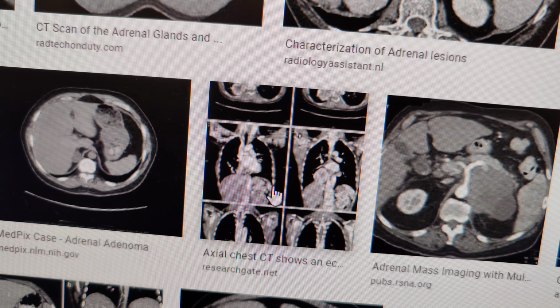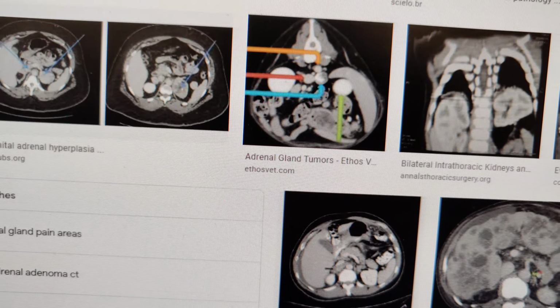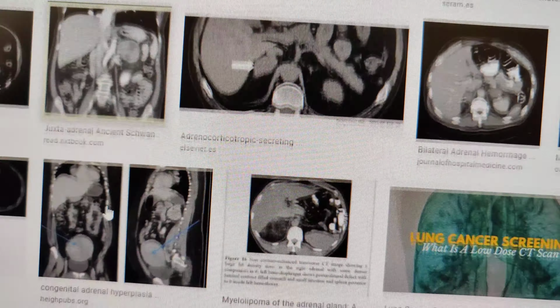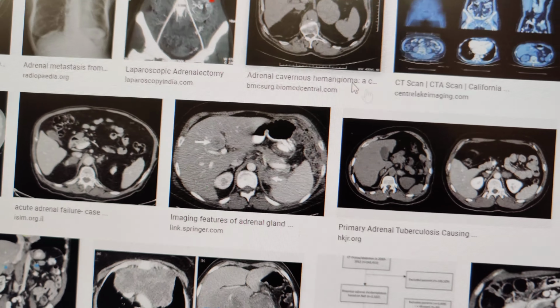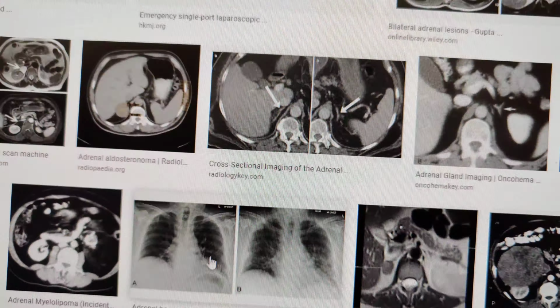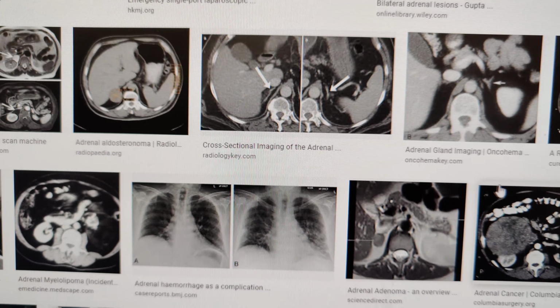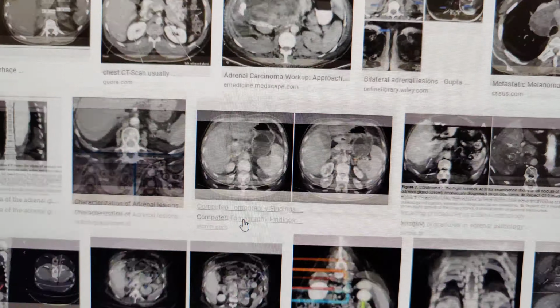And then you do want to get the whole lung. So when you get your scout, you're gonna have an AP and a lateral, so make sure you get both, because people's breathing is different when you scan an AP and a lateral. There isn't one on Google that we see that's nice, but anyways, just make sure you get both AP and lateral, because the costophrenic angles will be different for both. The diaphragm will move, and then you might clip it off if you don't get both. So it's very important to get both.